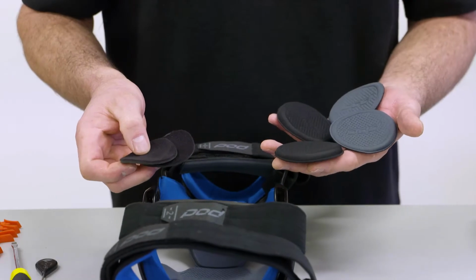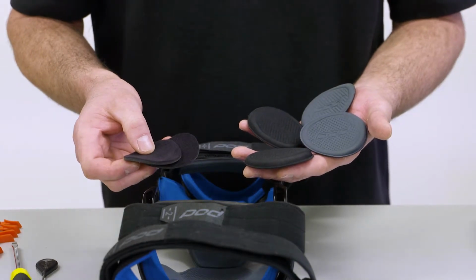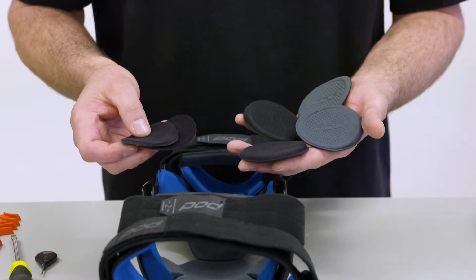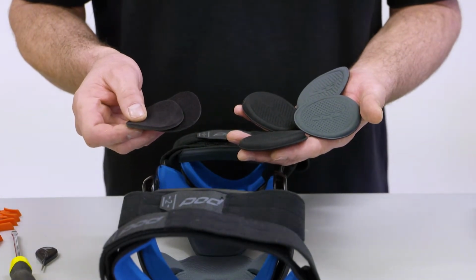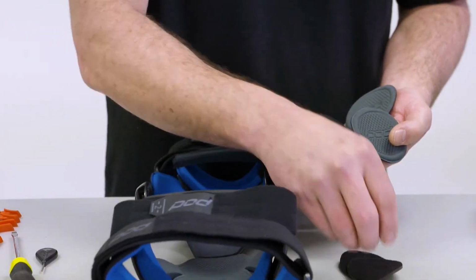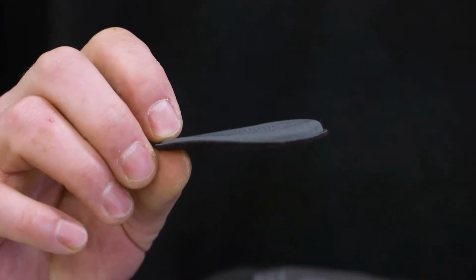Now that you've reattached the hinge housing to the frames and the new ligaments are in place, if you still have your original packaging or if you've purchased new padding from your dealer or online, you'll know that you received the grey, thinner knee pads, the thicker knee hinge housing pads, plus the high density shims. So these allow you to actually pad out the hinge housing to tailor it for even pressure for your knee. We're going to be putting the grey thin pads into this K8 knee brace today.